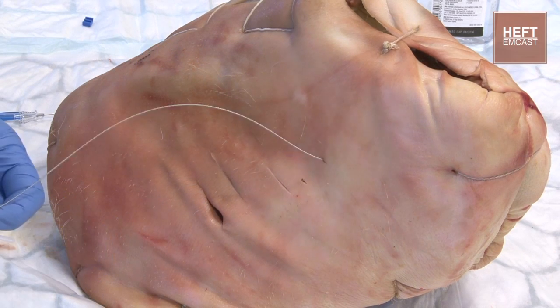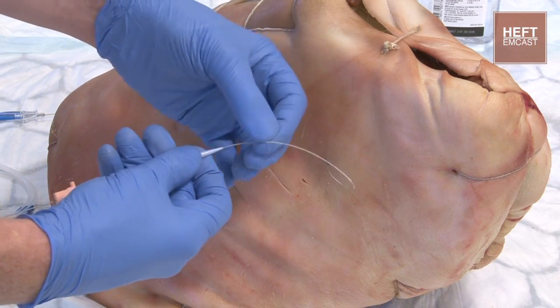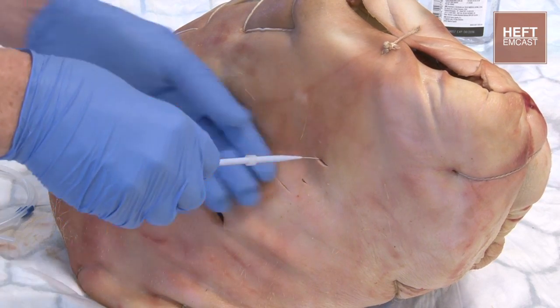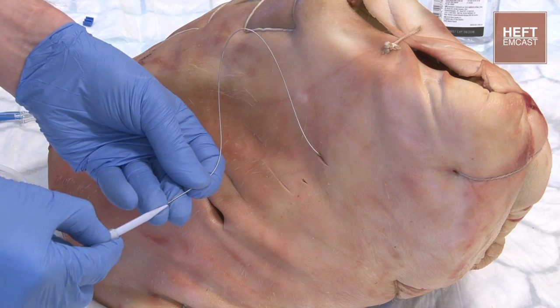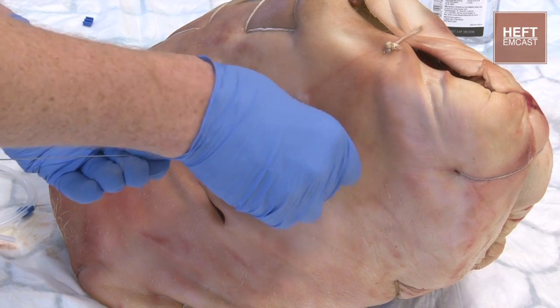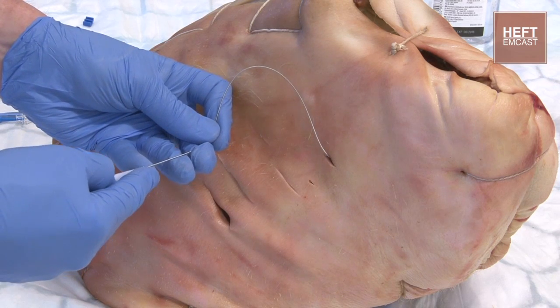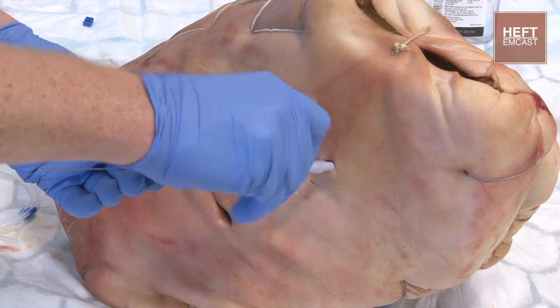We'll take the introducer and just pass that onto the wire, dilating up our hole. Take that back out, go to the next dilator, dilate that up. And finally the biggest dilator — dilate the hole to the biggest maximum diameter.